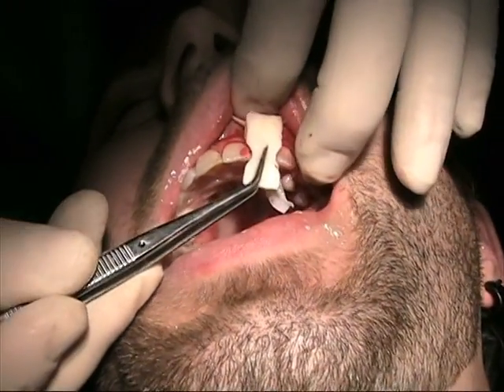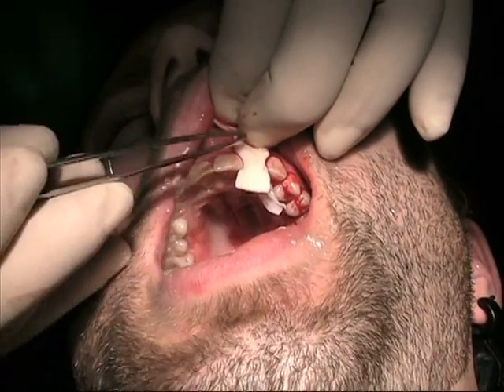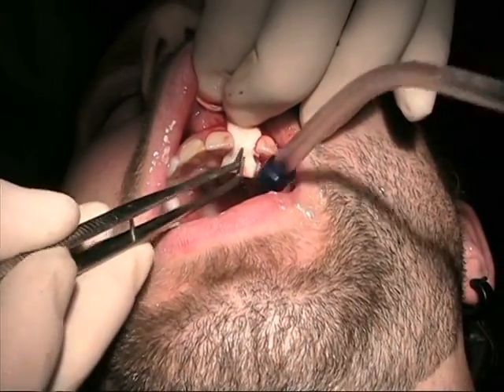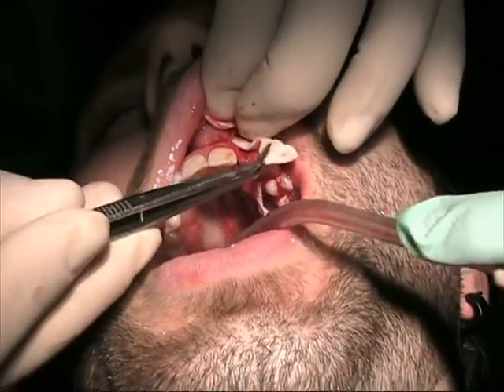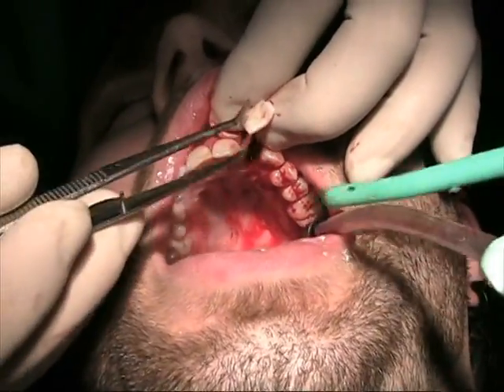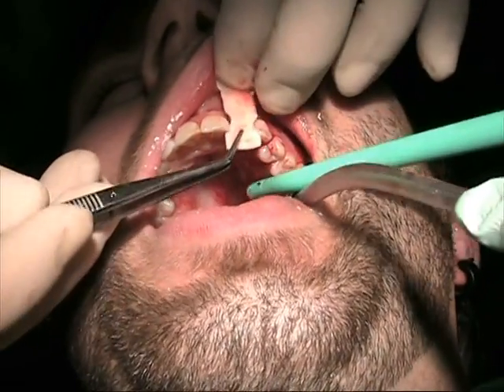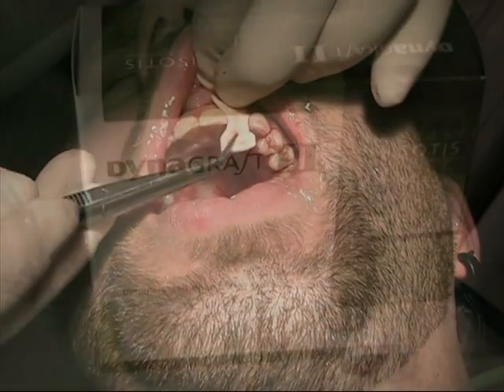The Alloderm is an acellular dermal matrix. I've already trimmed most of it and as you can see it's going to have plenty to cover the facial aspect and it'll tuck right underneath there. A little bit of a smooth trim approximately — you don't want to leave this tissue right against the tooth of course. It's all going to be tucked underneath. This has been sitting for 10 minutes. So now we're going to place this in the forward flap that I've created.